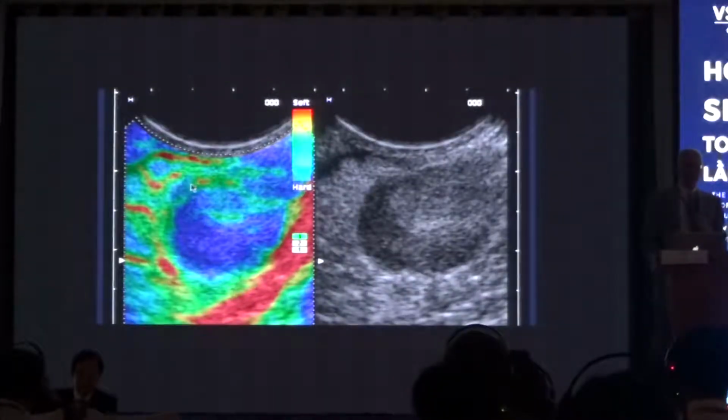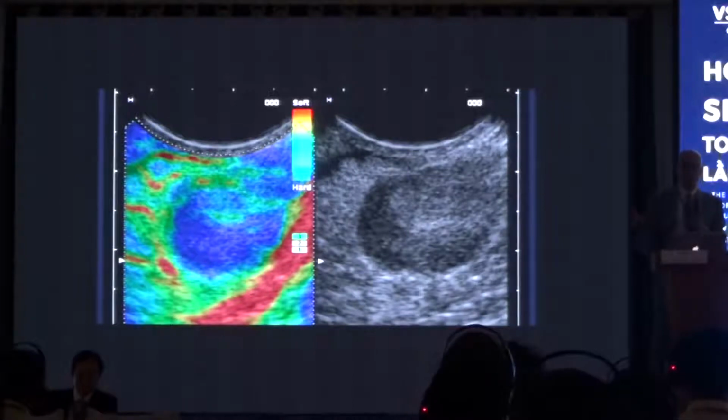Again, a lymph node, this was in the colon. Colorectal carcinoma, a normal part of the lymph node, the malignant infiltration stiffer than the surrounding tissue. Endoscopic ultrasound using the Hitachi platform, blue is stiffer all over the world. So this is in accordance with the guidelines.